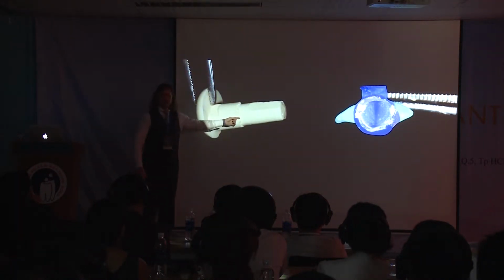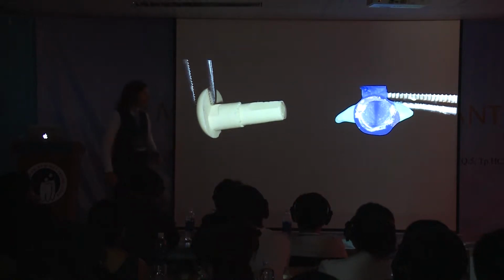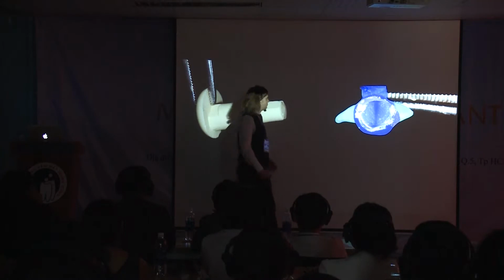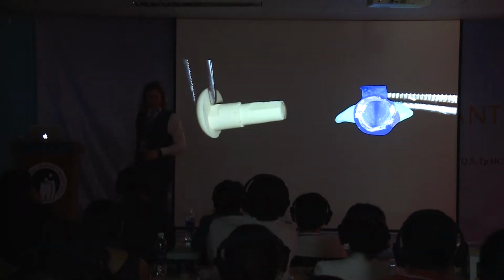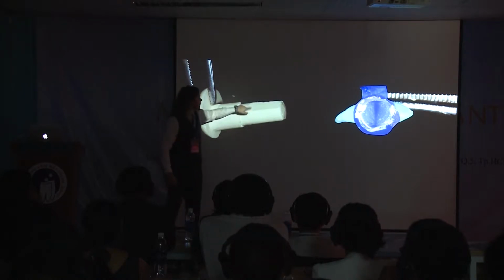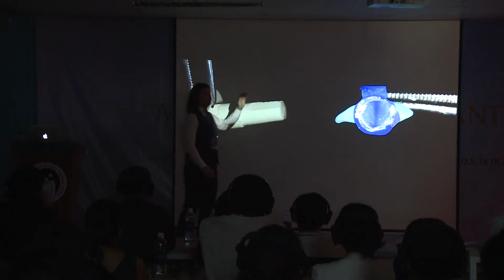This is the replica of the abutment that the technician did. He did the replica with epoxy resin at low shrinkage, and he created this precision cap that snaps on top of this abutment. There's no shoulder in this abutment. This is the analog. Shoulderless. So I can choose in the future where I want to finish my prosthodontics.